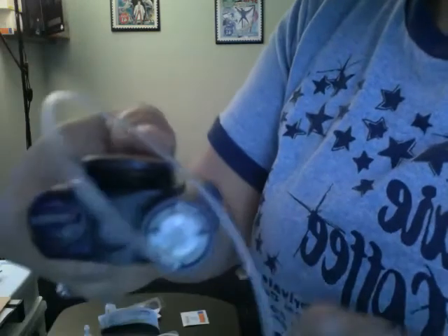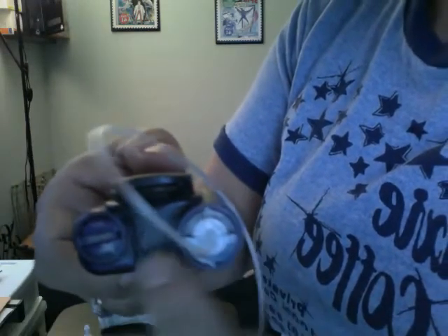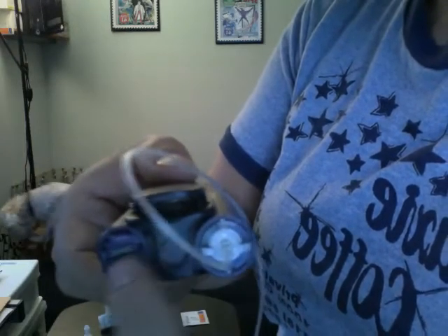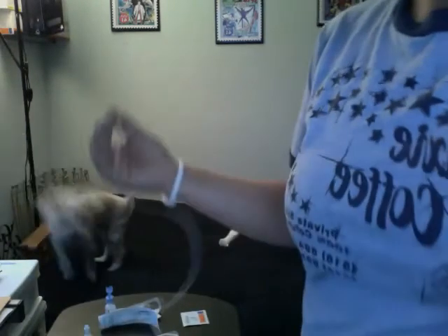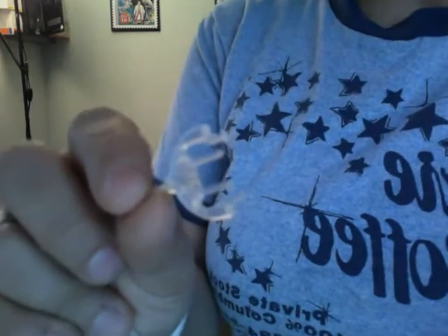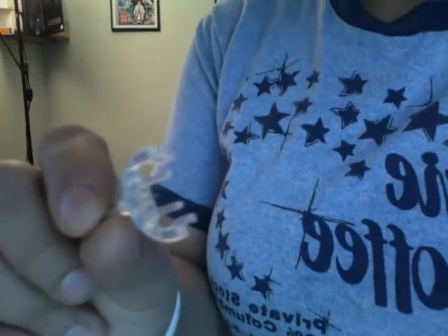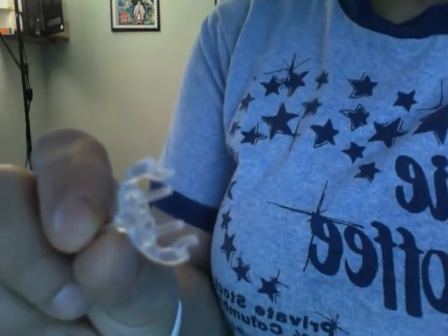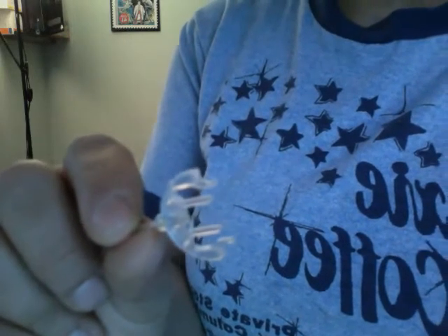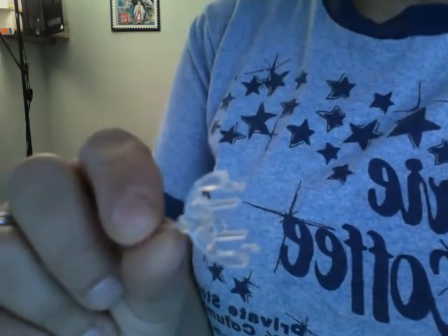And from the top of the pump, this line should be the same way as the battery line. That's how you know it's in correctly. Okay. And now it says preparing to prime. So I'm going to look at the end of my tubing to see when about 4 or 5 droplets come out. So I'm going to hold down my act button and wait for those droplets to come out. There we go, about 4 droplets. Let go of act, and I hit my back button.